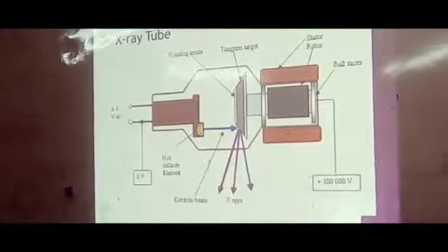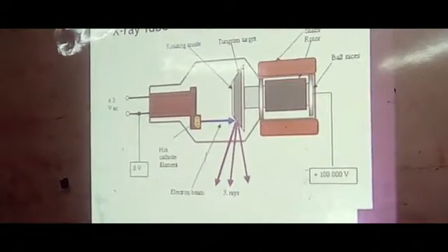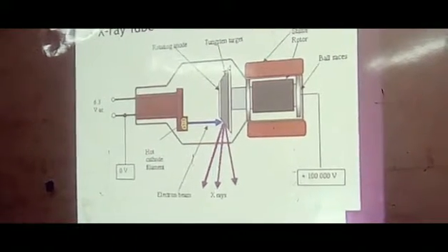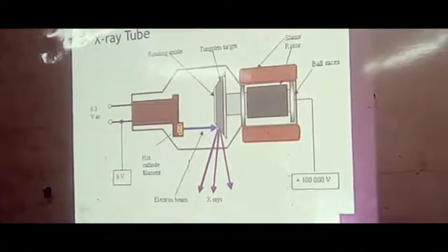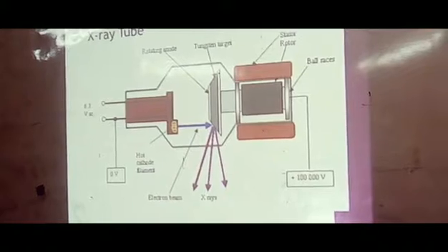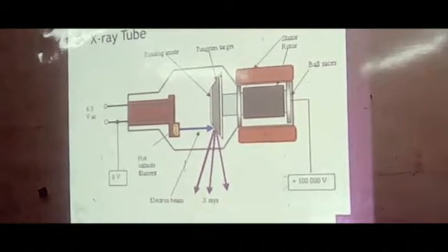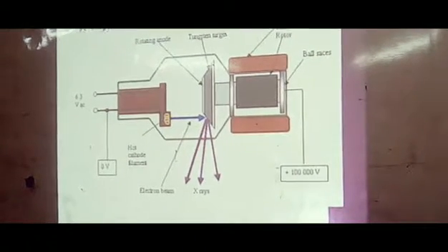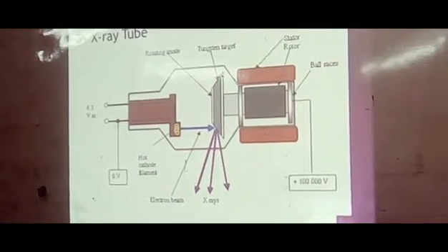Parts and functions of a fluoroscopy machine. First, the X-ray tube. It converts electrical energy provided by the generator into an X-ray beam. Bifocus tubes are common. They use a small focal spot, approximately 0.3 to 0.6 mm, for image recording, or the large focal spot, which is 1.0 to 1.2 mm, for high tube current. It produces electrons by heating, and the anode is made of tungsten. It is positively charged and struck by the accelerated electrons for the emission of X-rays at the focal spot. The anode angle ranges from 7 degrees to 20 degrees.